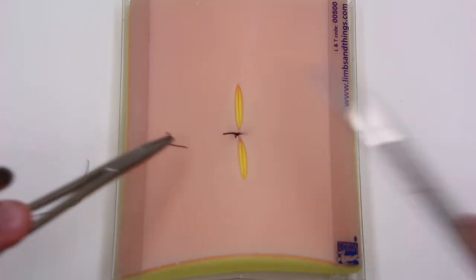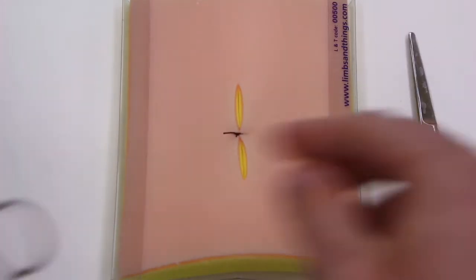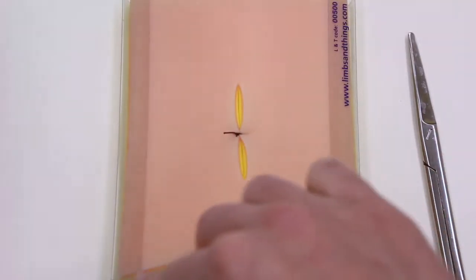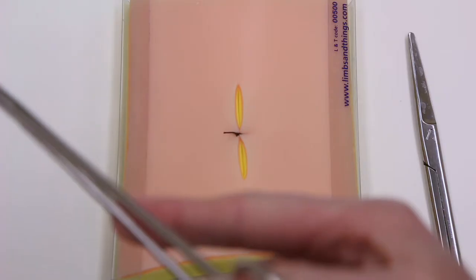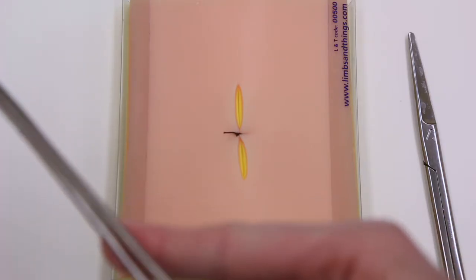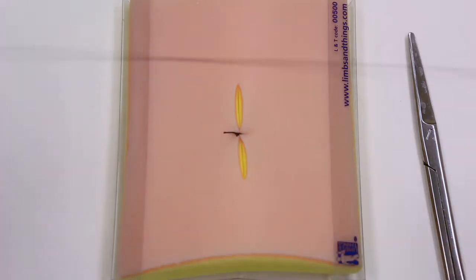Your general goal is just to get even sutures. You don't need to get right down to the knot in this because you're going to need to be able to find this to take this out later. So just make sure you have about even ends. The rest is less important there.